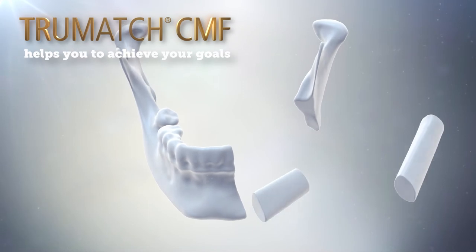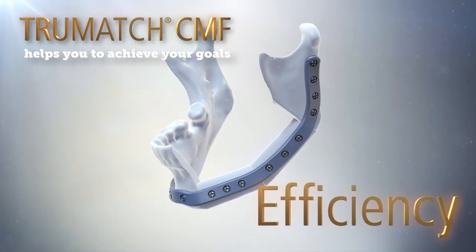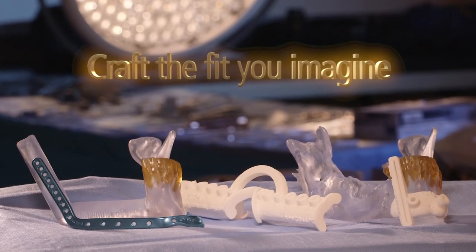TrueMatch CMF, helping surgeons achieve their goals of accuracy, efficiency, and patient benefit. The patient-specific plate for mandible — now you can craft the fit you imagined.